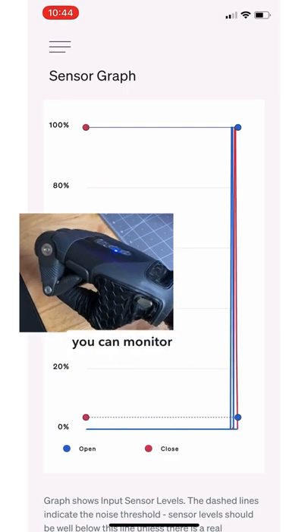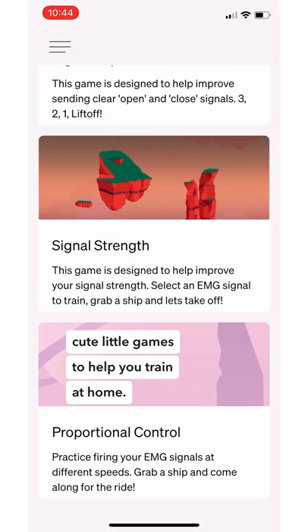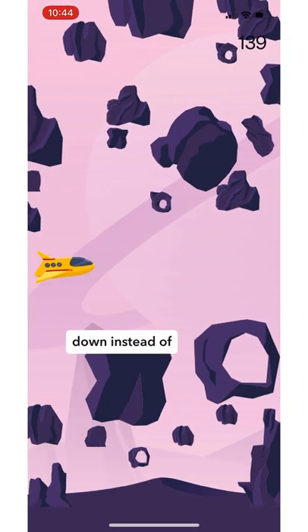Here's a real-time sensor graph so you can monitor your electrical activity. They even have some cute little games to help you train at home. This one's basically a Flappy Bird clone, except I'm using my muscles to control the ship up and down instead of a keyboard.